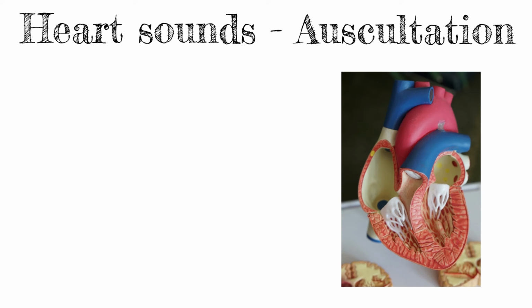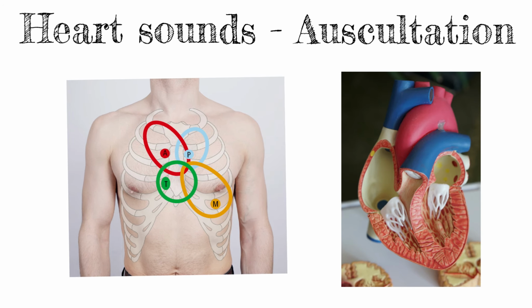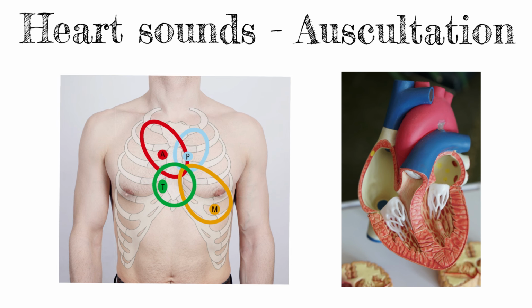Okay, hi everyone. So in this video, we're going to be looking at auscultation. Obviously, as you all know, auscultation is listening to the heart with a stethoscope, and you're trying to pick up different pieces of information. So in this video, I'm just going to be talking about where you would listen with the stethoscope.